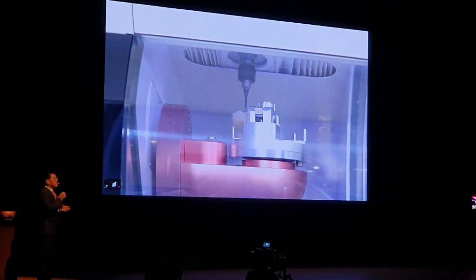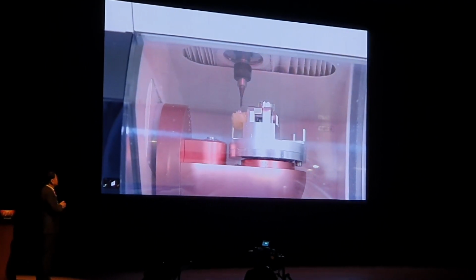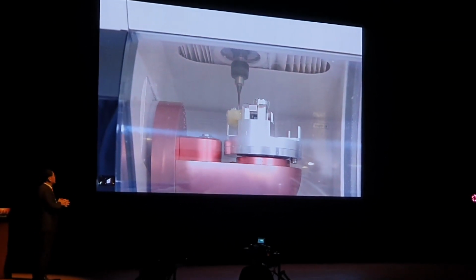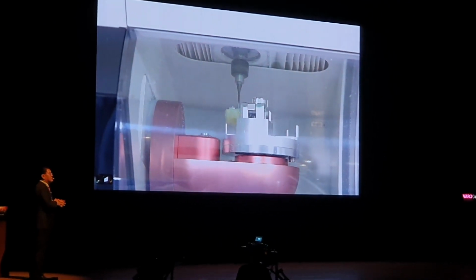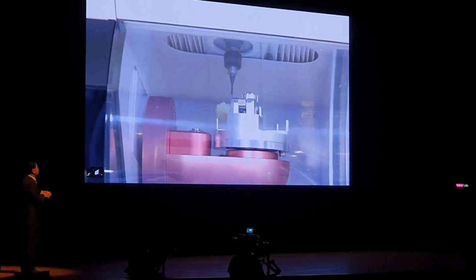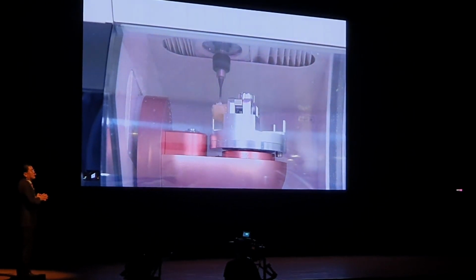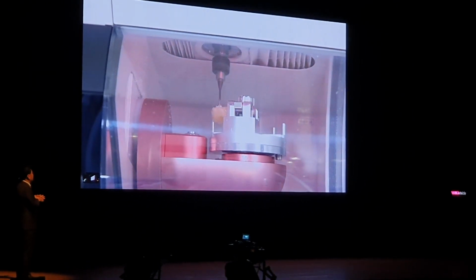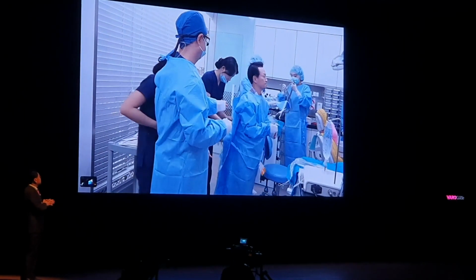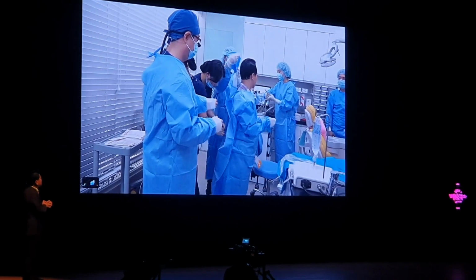Oh, I think it's the first time that I see a clinician placing an implant on himself with the guide in live surgery. A great devotion just for the pleasure of the audience. It makes us really nervous just by watching it. Both the surgeon and the patient are wearing scrubs and now wearing surgical gloves.